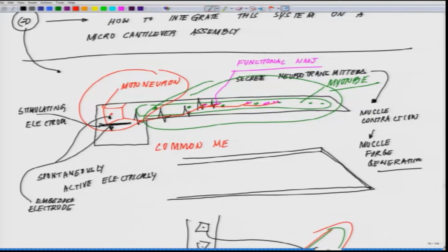and secondly, once you develop a common medium, which again has to be a defined medium, serum free, how to plate the cells. Whom are you going to plate earlier and whom are you going to plate later.